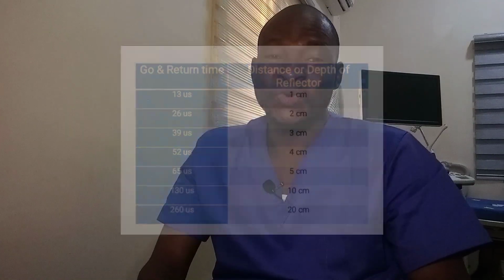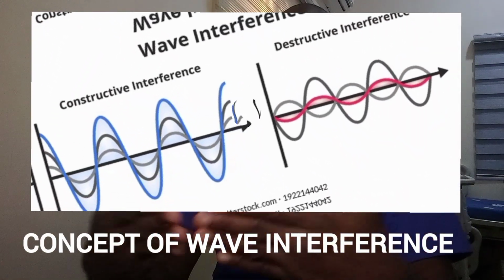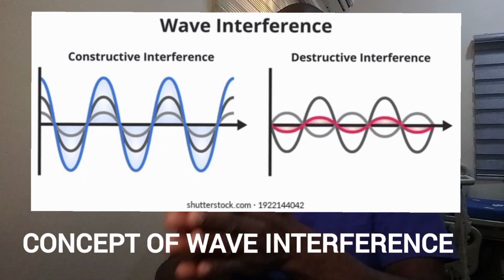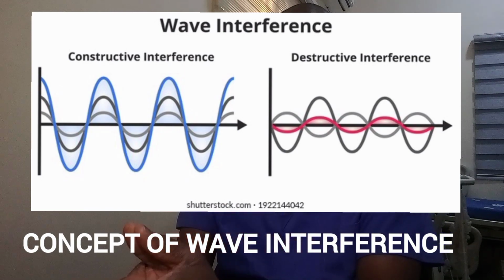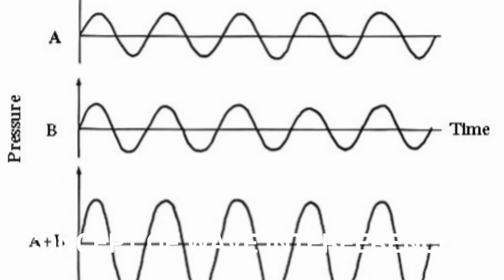Now, what is the concept behind wave interference? When 2 or more waves arrive at the same location at the same time, they will interact to form a new wave, and this is called wave interference or wave interaction. Now, the resultant wave may have a different amplitude or frequency depending on the amplitude, frequency, and the phase of the original waves.